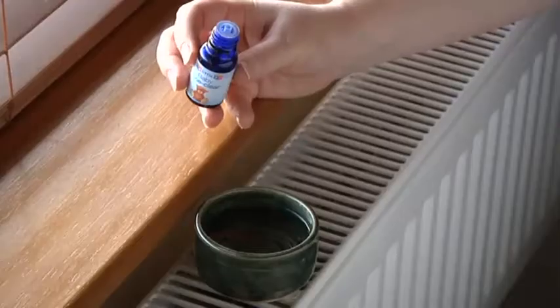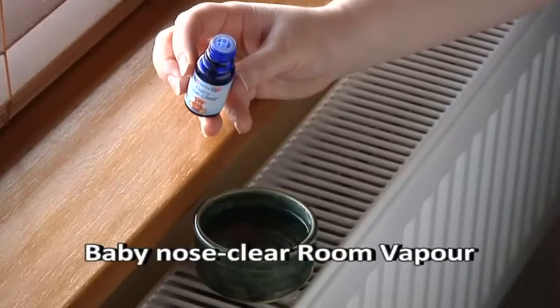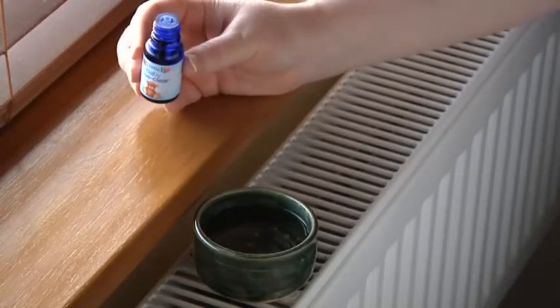Once the nose is clear, it is really useful to also use the Baby Nose Clear room vapour to help keep baby's nose clearer for longer. Again, this is safe to use from birth.